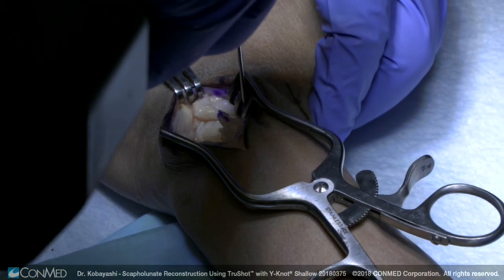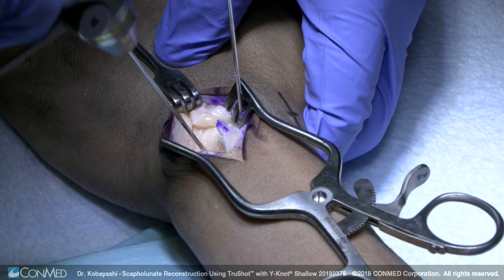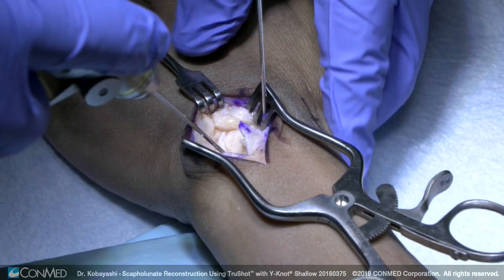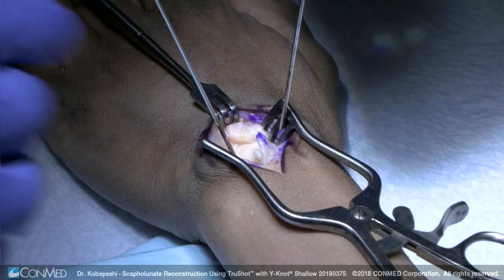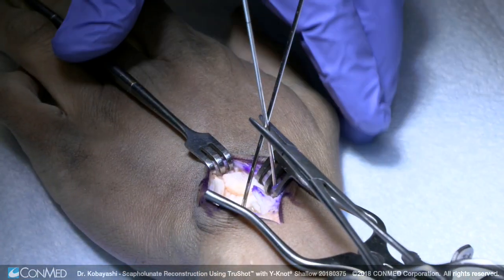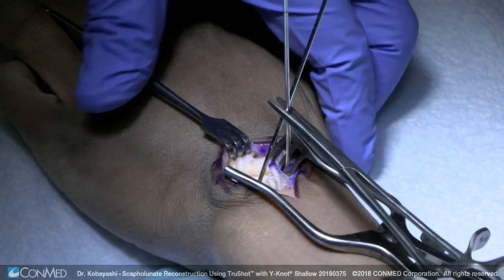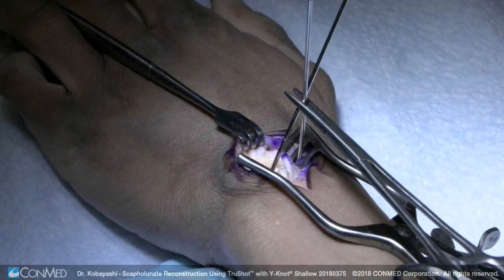We'll put a pin here, pin in the lunate. Just want to make sure that it stays out of the way of where you want to put your K-wires. This here will reduce it. Now this is pretty well reduced already, but that typically reduces the scaphoid to the lunate, and then we'll add our fixation here radially.